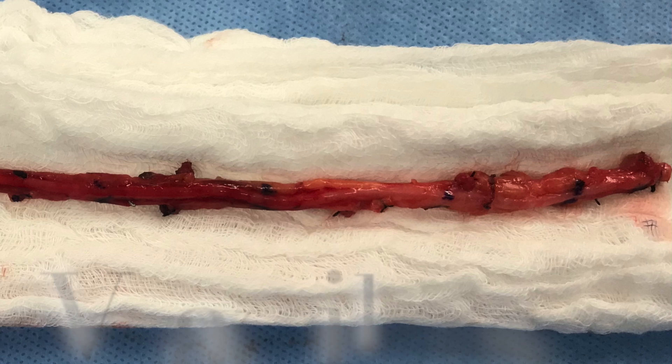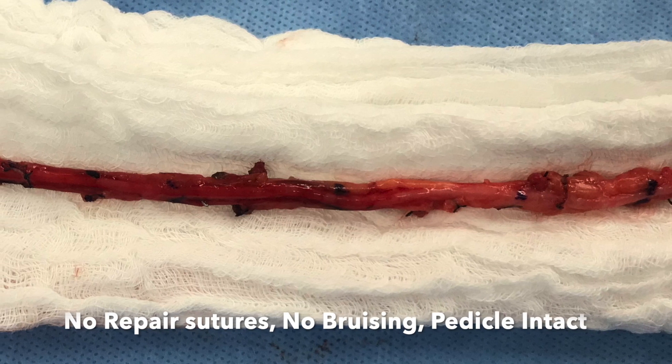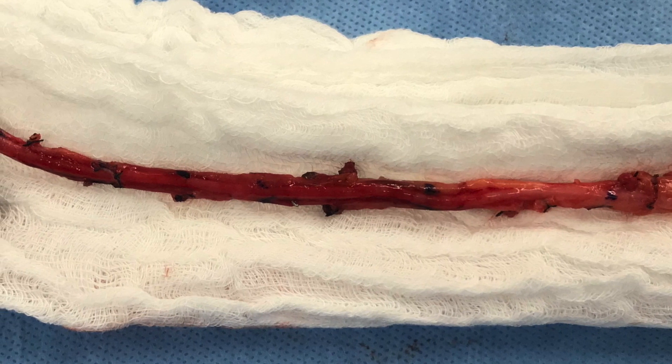And that's what the artery looked like when I was done. I had no repair sutures, I had no bruising, the pedicle is intact. And we're ready to go.